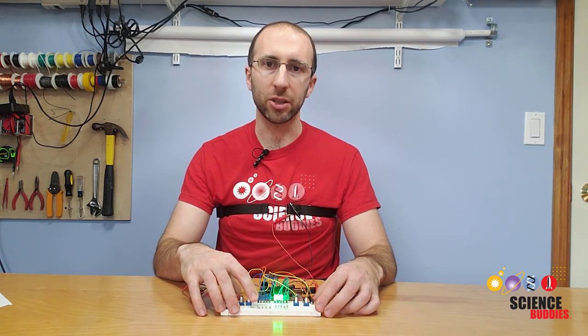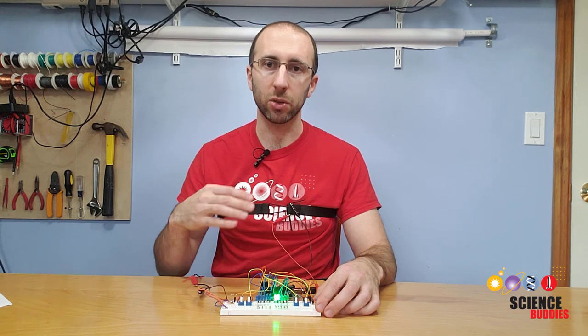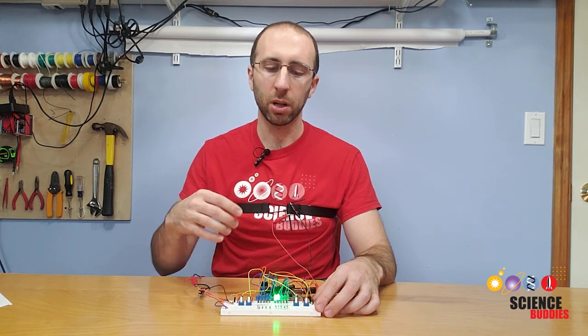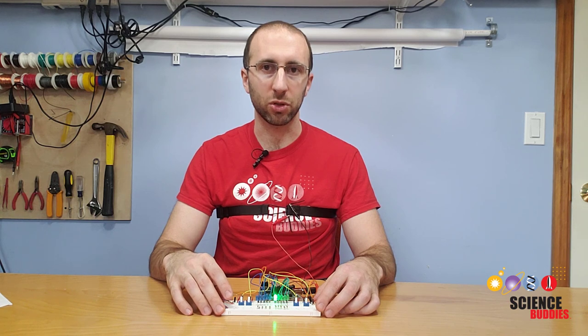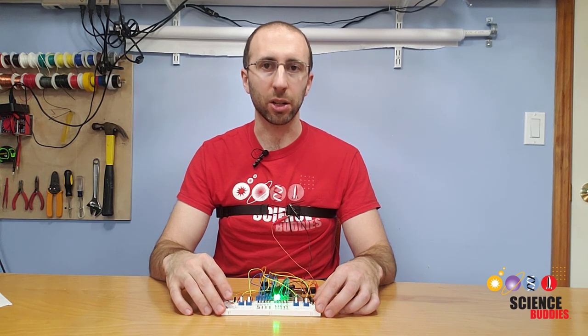The Arduino then lights up two different sets of LEDs, one for the chest and one for the stomach, proportionally to the amount of stretch. Let's zoom in and take a closer look at the circuit.